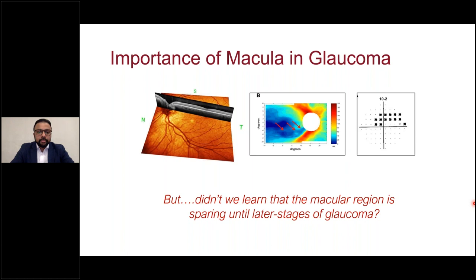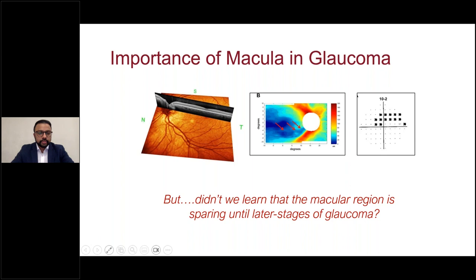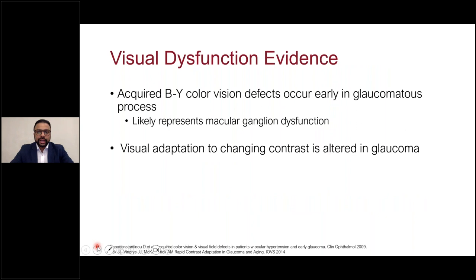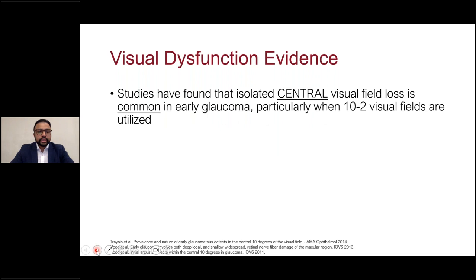Let's talk about the macula. Traditionally it was taught that the macular region was spared until later stages of glaucoma — supported by largely preserved central visual acuity until end-stage disease and peripheral visual field defects working their way inward. The mantra was 24-2 until you can't do 24-2s, then switch to 10-2s. But there's a plethora of evidence over the last decade indicating both structural and functional macular involvement throughout the spectrum of glaucoma. This includes blue-yellow color vision defects early in the process, likely representing macular ganglion dysfunction, and loss of contrast sensitivity even in the earliest forms.